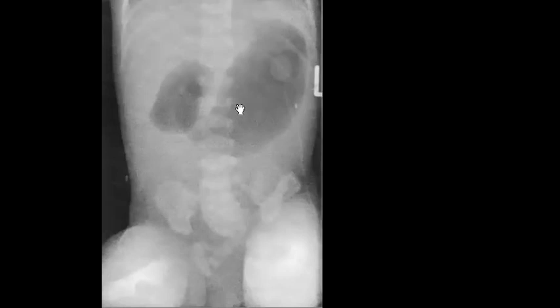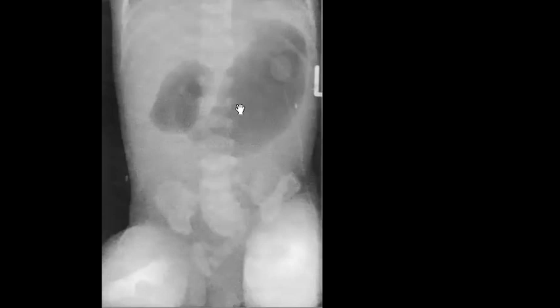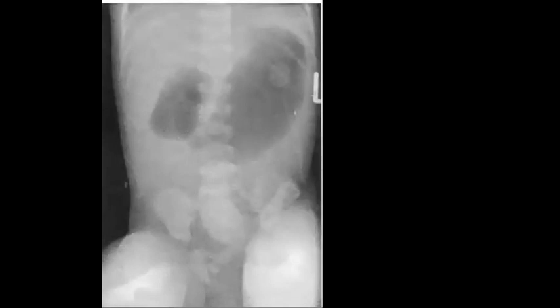So the most important associated congenital anomaly will be Down syndrome. Exactly, Huda. Thank you. Down syndrome and duodenal atresia, D with D. Okay. The importance of the upper GI contrast study is to differentiate from other causes of obstruction. We mentioned this before, if you remember.